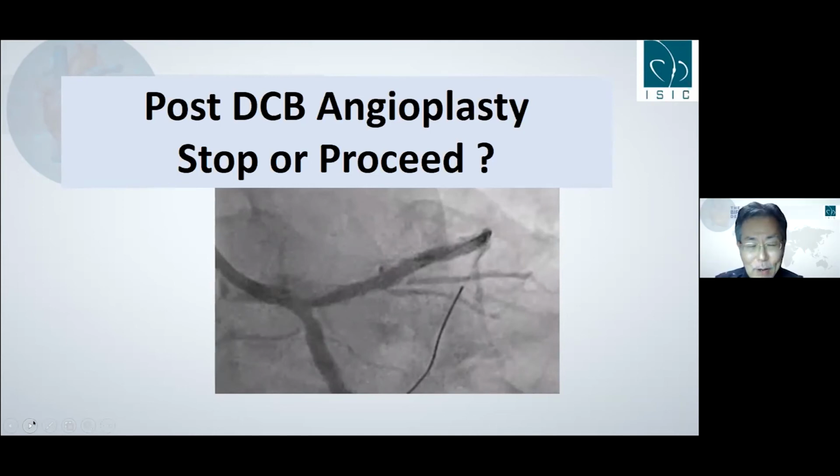Yeah, this is the fear of the previous opinion. The proximal LAD and left main still remain the stenotic region because of the plaque burden, much more plaque burden located there. So cutting balloon or high pressure kissing balloon inflation could not modify it enough. In such a situation, this configuration carries a fear for restenosis in the left main, distal left main.